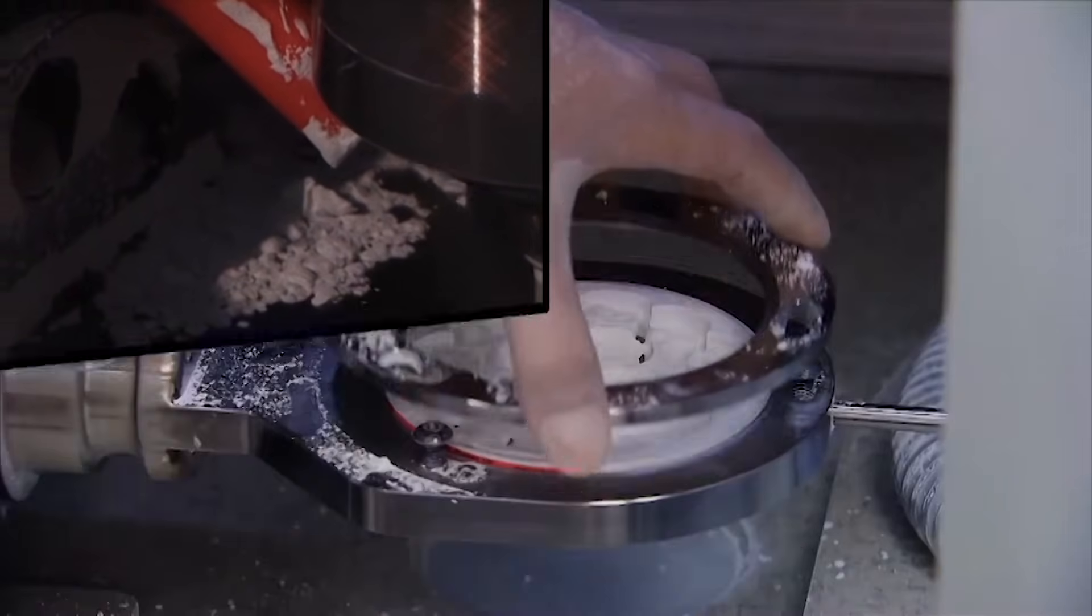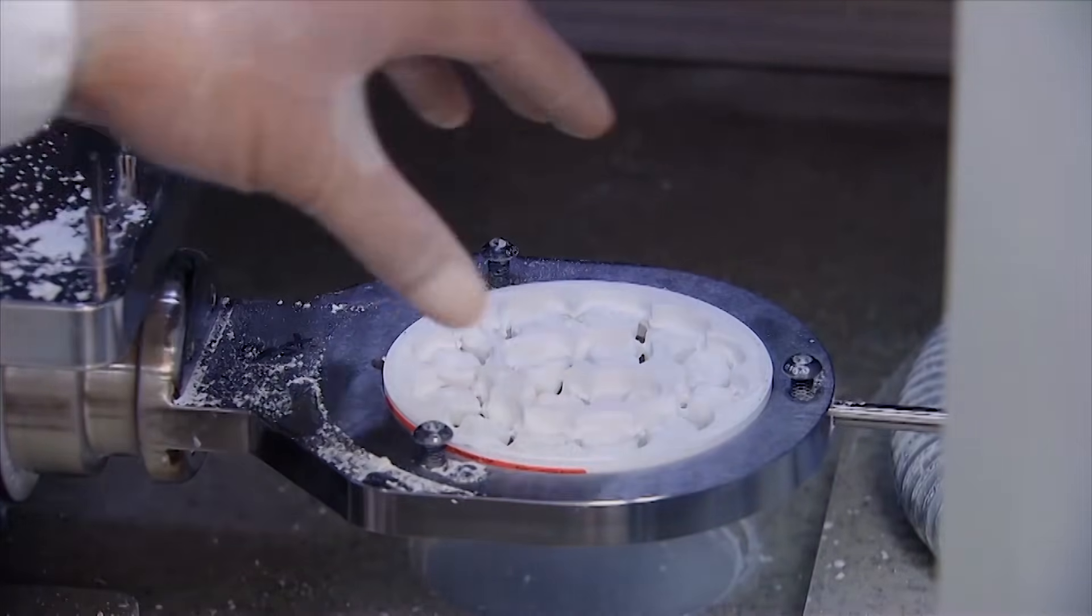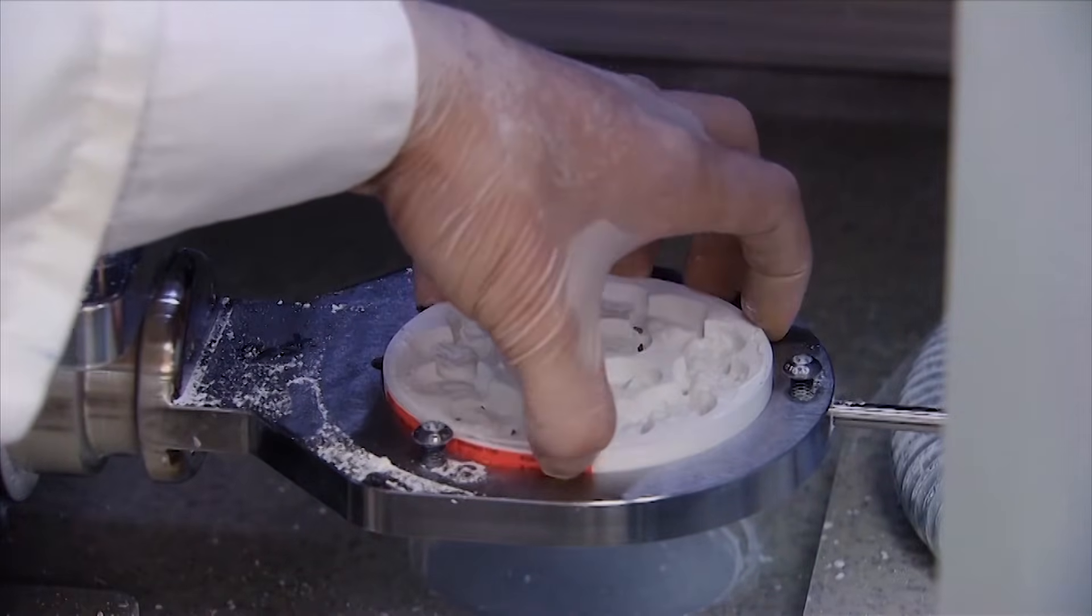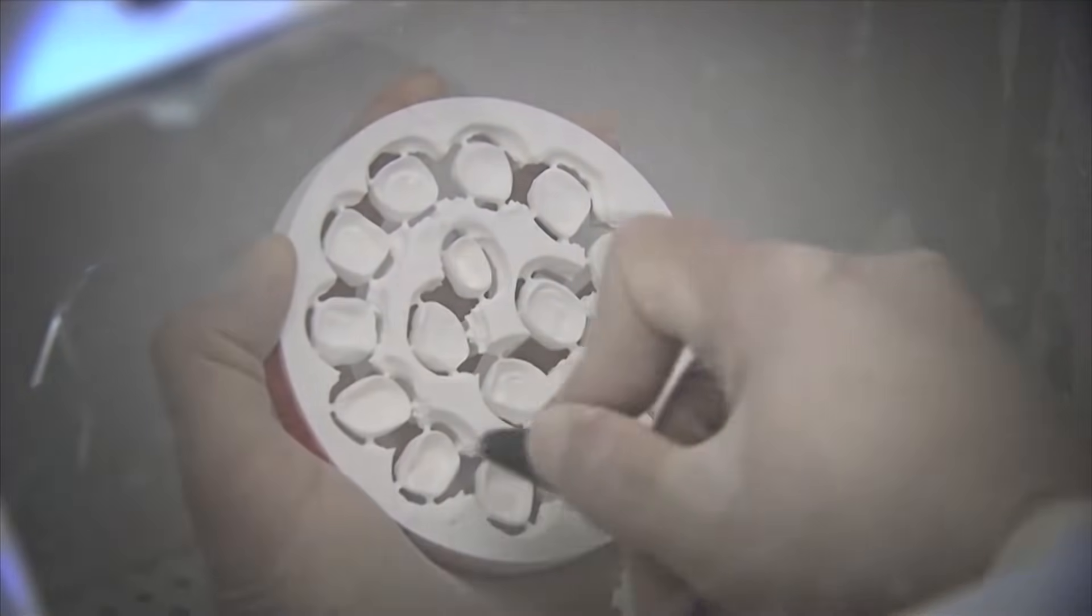So there's an exact factor for each block based on the weight and density of the zirconia. Once that's been measured, that's what that barcode tells the milling machine, so it knows exactly how much bigger to make those crowns. You can see they look huge.